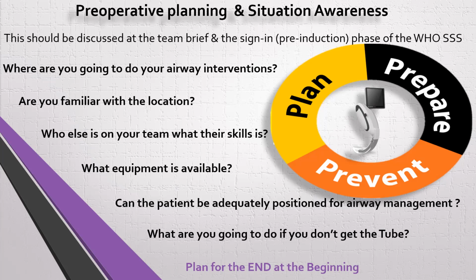Do you have all the equipment for difficult airway management? What about a suction device? What if you want to bring equipment or a device from somewhere else? How long would it take to get this device in your hand? Can the patient be adequately positioned for airway management?